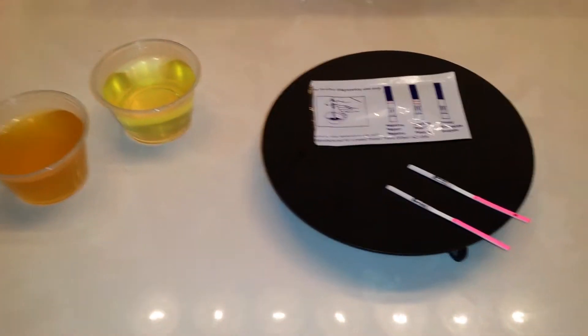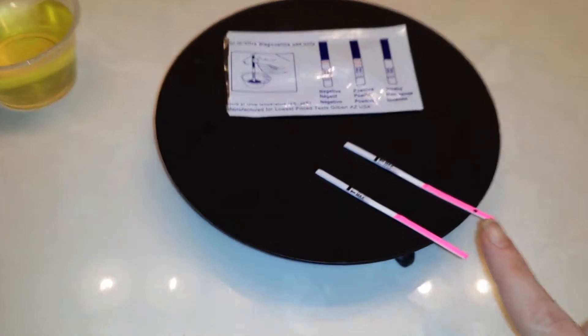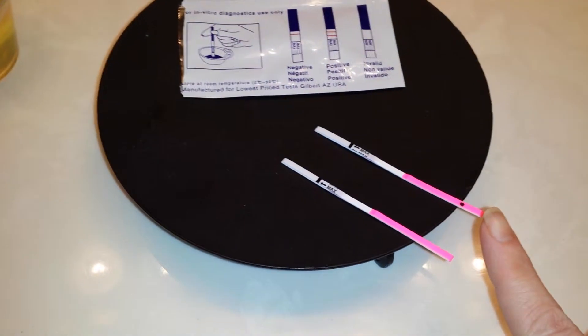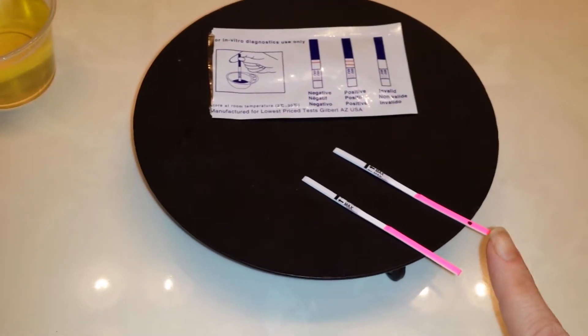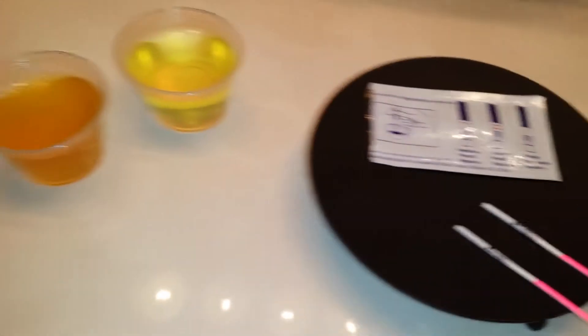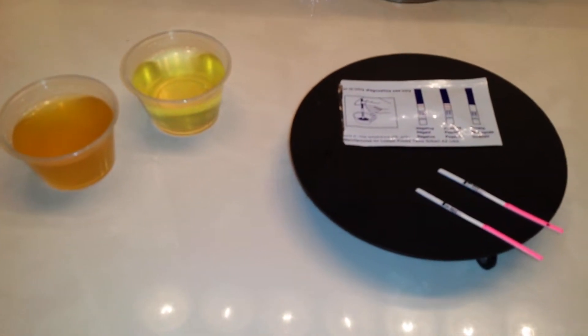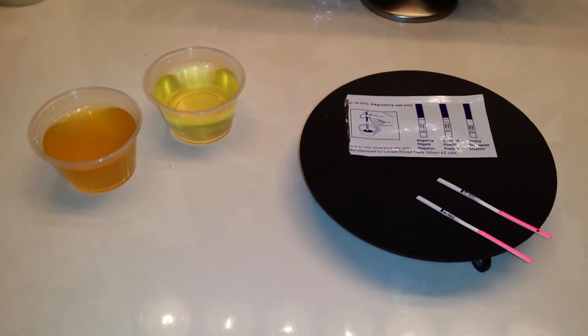So what I'm going to do today is take two ovulation test strips and I've marked one of them with a black dot. That's going to be the one that I dip into the diluted urine and this one will be the concentrated urine.